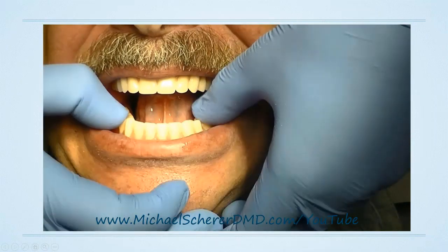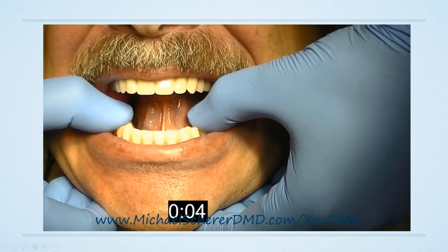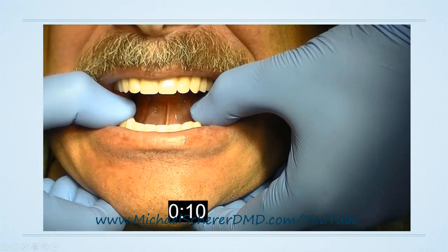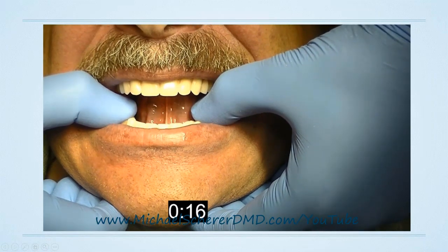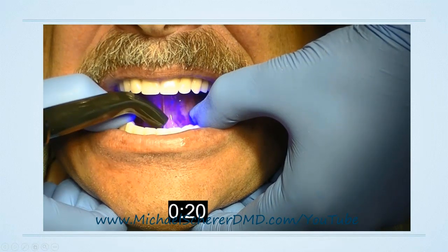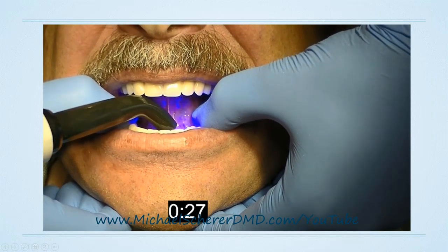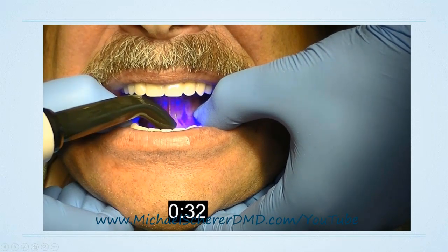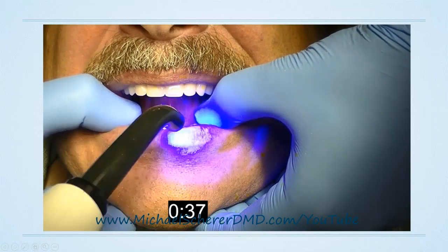I'm going to seat onto the edentulous ridge, and my preference is to hold the patient's denture down with my fingers. I don't really like having the patient bite down into centric or into MICP while we're doing this pickup procedure. Many of you might be saying, well, that's the way I learned. Isn't that the way you're supposed to do it? Keep in mind, ask yourself the question: how many times if you ask a denture patient, "Oh, bite down," do they bite kind of goofy? Like, oh, there's my teeth sticking out, or they go into protrusive. Absolutely, like every denture patient will do that.